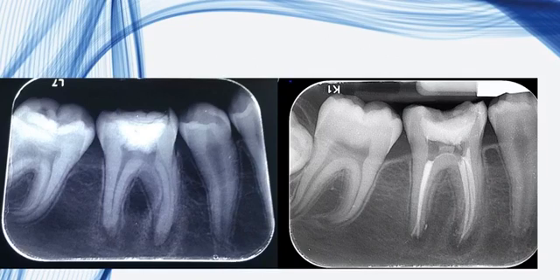This is a big canal on the distal, so I started with a 25 6% at the entrance, to the resistance at the middle, in rotational motion. Then I continued to the apex with a 25 6% in reciprocating motion.